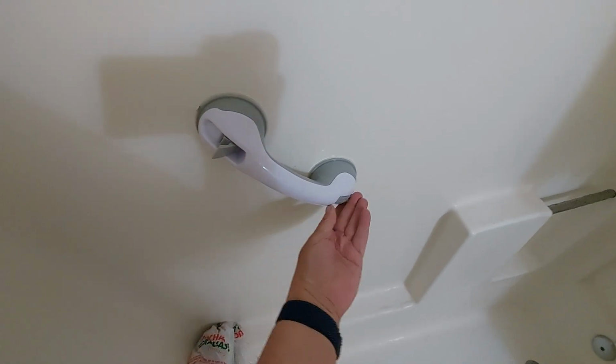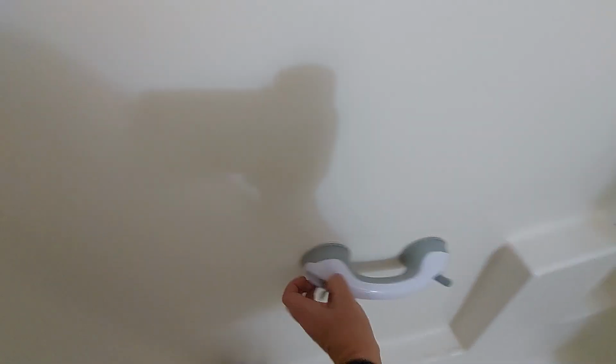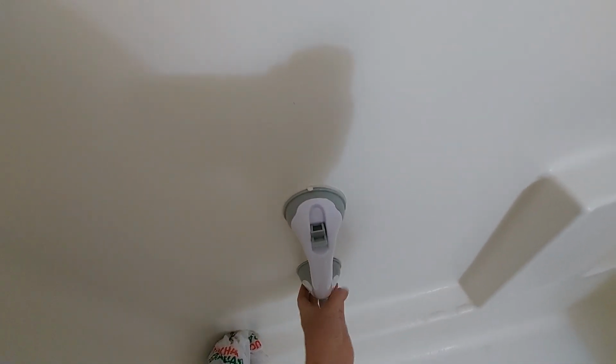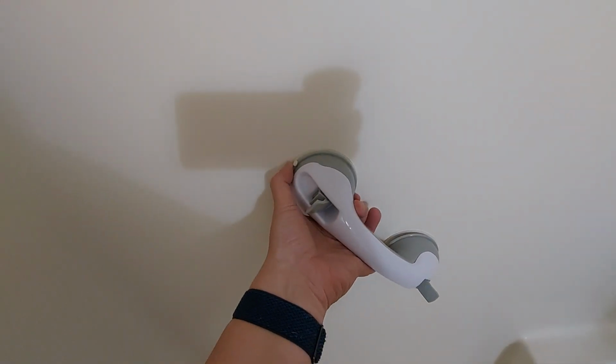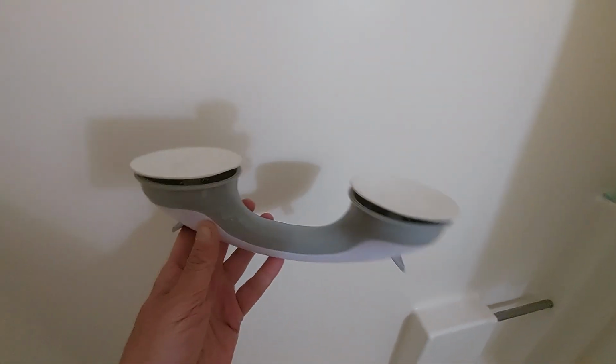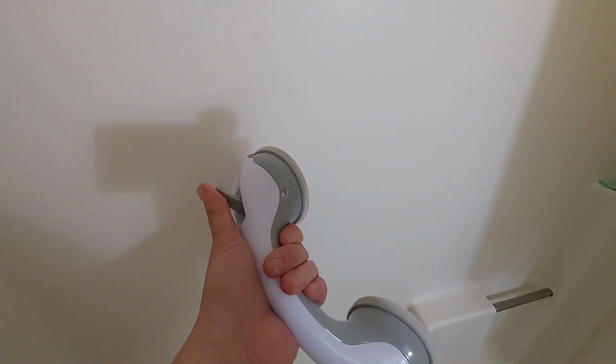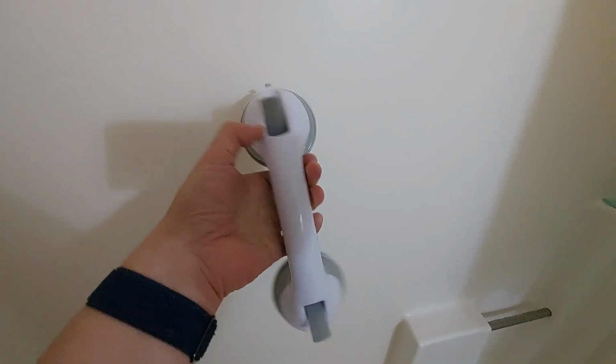When you're done using it, you just pull these off, and then your suction cups are going to let go. You've got these little tabs, and if you pull on those little tabs, it'll let the rubber come off. Leaves no marks on the shower stop, on the bathtub. And now you can take this with you and use it the next place you travel to.